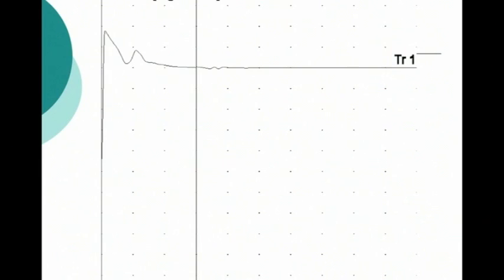Here's a response where the m wave is small. I mean, I would use that, either small or absent, but in this case, there is no H reflex, and we should not measure that. This recording will be called an absent H reflex.